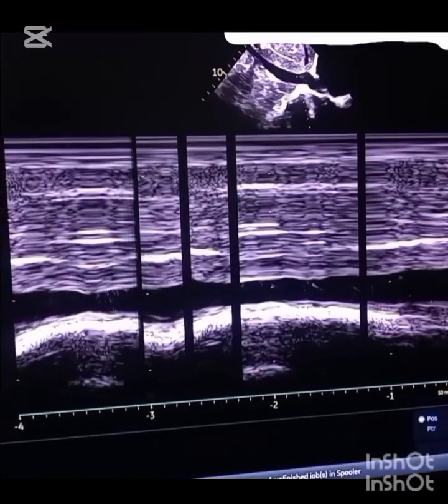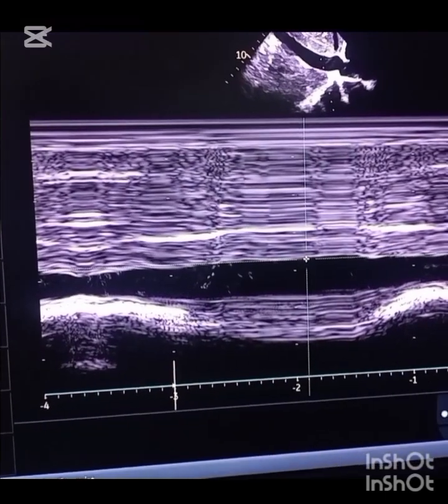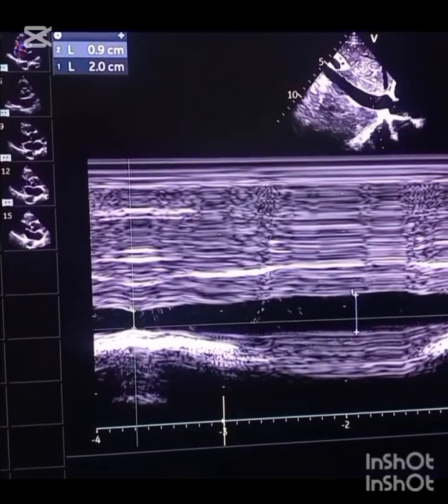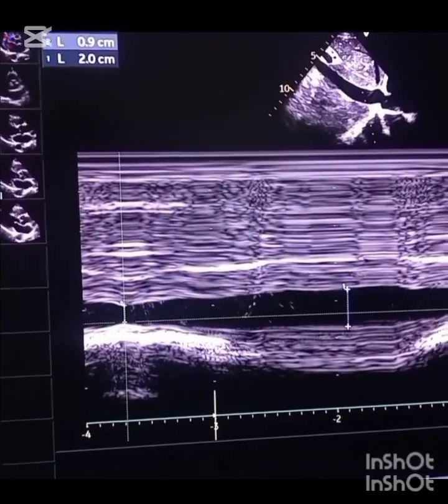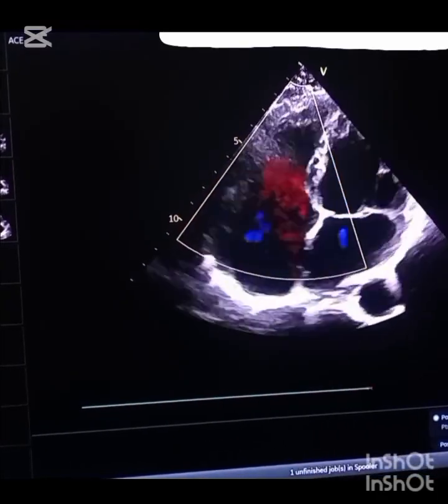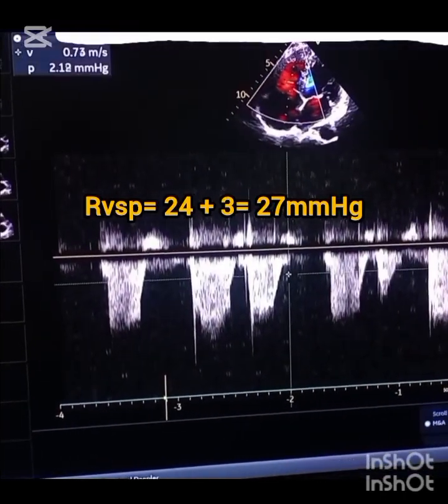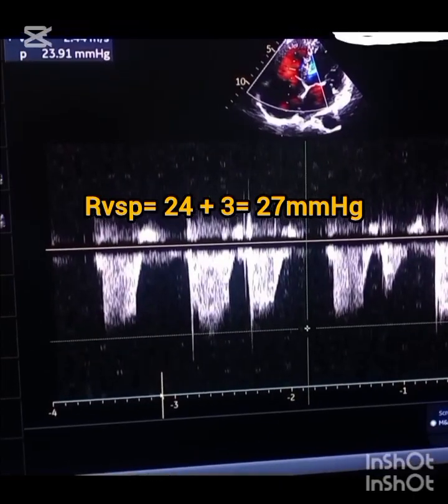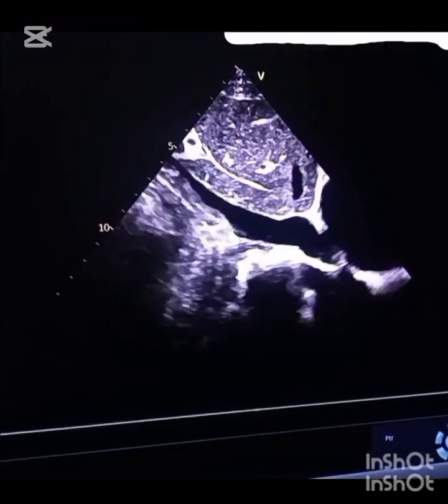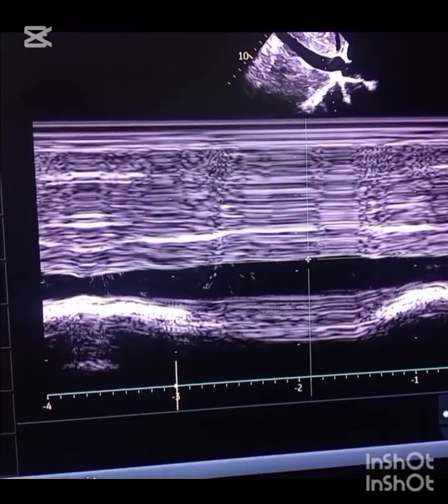The IVC in this patient measures 20 mm or 2.0 cm with good collapsibility, so we add only 3 mmHg of right atrial pressure. The total RVSP for this patient is approximately 30 mmHg or less — this is a normal right ventricular systolic pressure, not elevated.